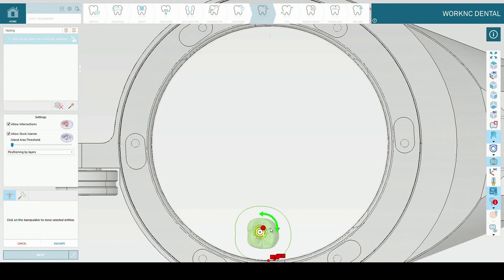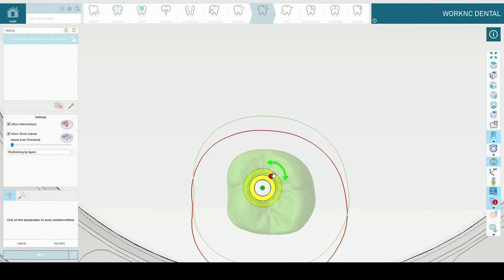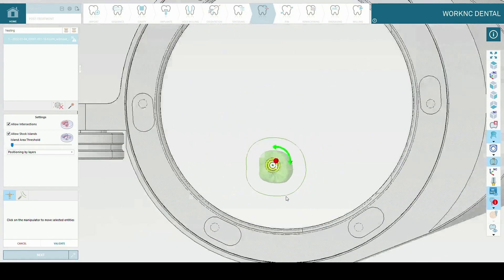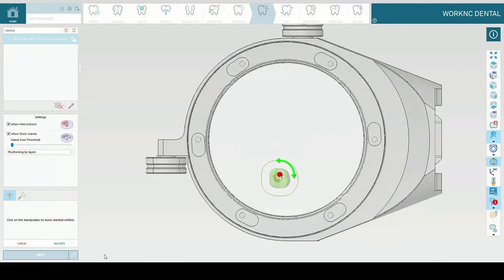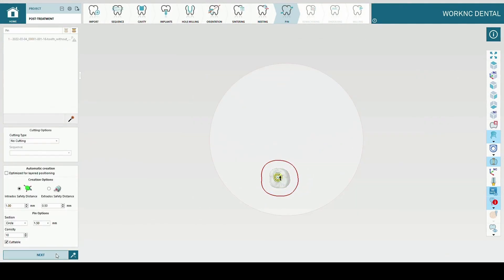In this section it's possible to change the orientation of the crown within the disk. When finished, press validate and next.